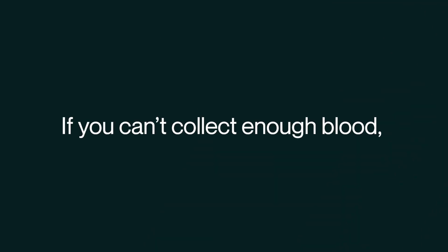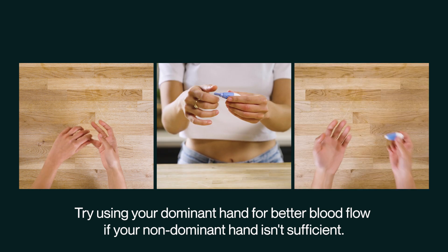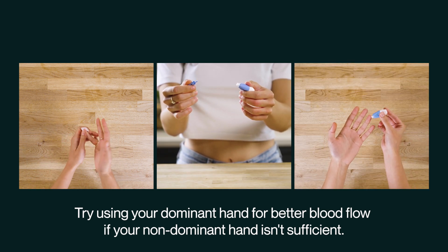If you can't collect enough blood, pause for 5 to 10 seconds and try to collect blood again without re-pricking. If it still isn't working, repeat the steps but with a different finger, by cleaning it with an alcohol wipe and using a new lancet.